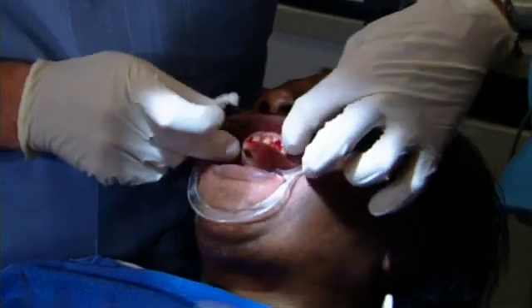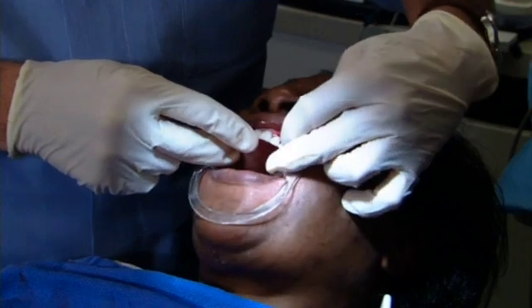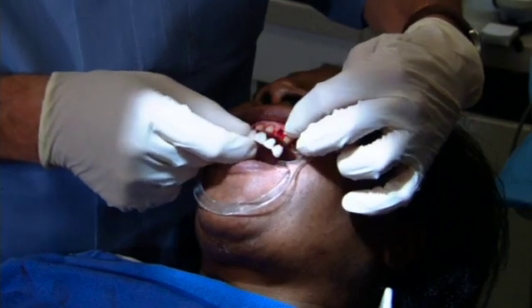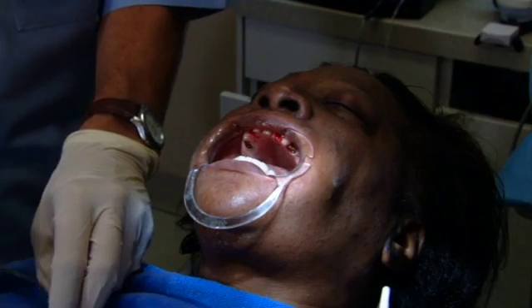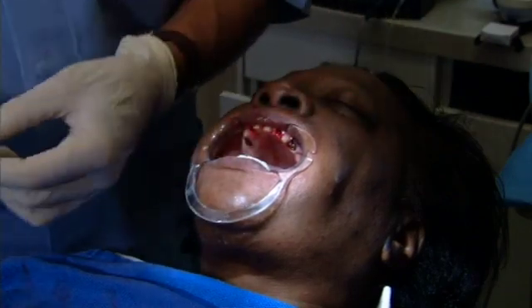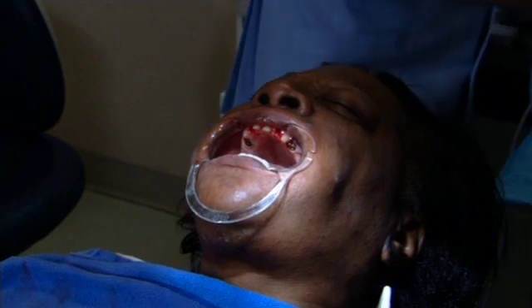What Kathy has done is she's put cavity varnish on the prepared teeth to protect them from the acrylic, and then we've coated those teeth with mineral oil, which will serve as a separator and a lubricating device so that we can get this thing off of there. If I didn't have a temporary partial to go in, I would be using a putty matrix to seat these crowns, but I'm going to use the temporary partial as a seating matrix. Now this provisional is acrylic on the inside, composite on the outside.